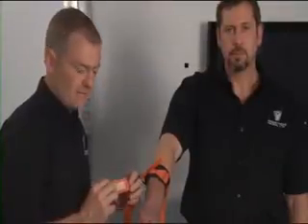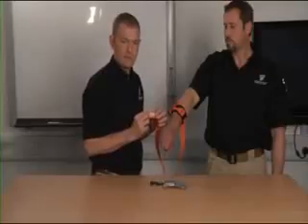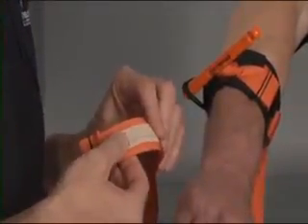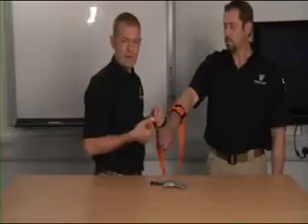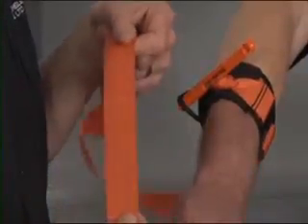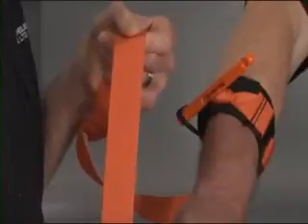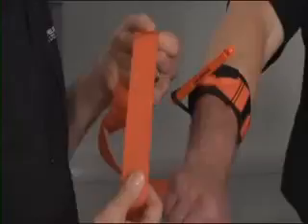On the Soft TW tourniquet there is a small patch onto which you can write the time; however, in practice in a field environment these can sometimes unpeel, so they shouldn't be relied upon for documenting the time of application. It's much better to make it very obvious either on the patient or on the patient report form, or if the material is orange it can also be written on with a permanent marker pen. Sometimes these tourniquets will be in service made in black materials, and of course you're not going to be able to write onto black webbing.